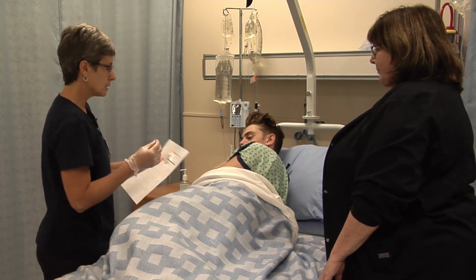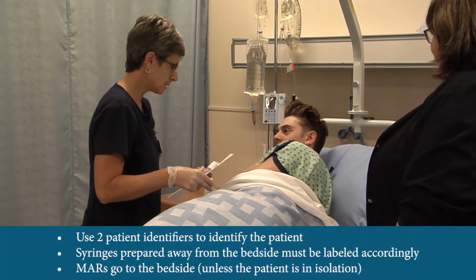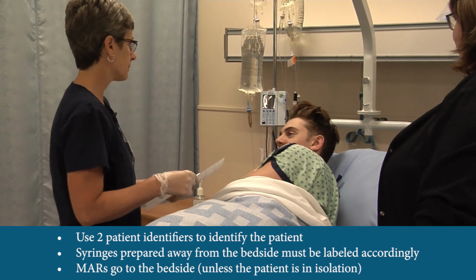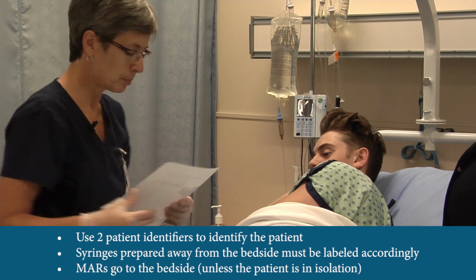Okay, so I've prepared my medication. I have my MAR at my bedside. Can you tell me your name and birth date, please? Ross Geller, March 3rd, 1999. Awesome. So I have your morphine for you, Ross, okay? And I'm going to put it into your hip.